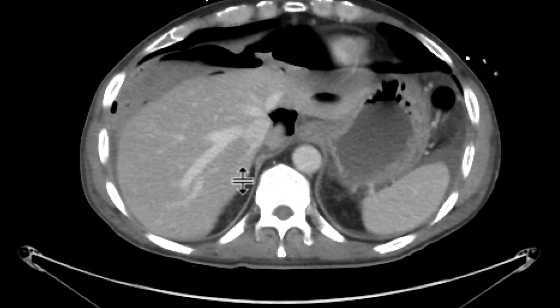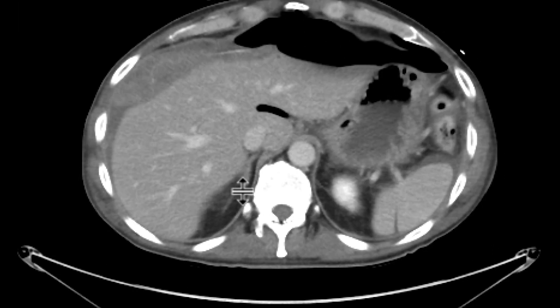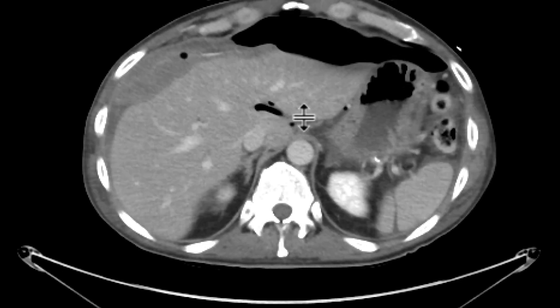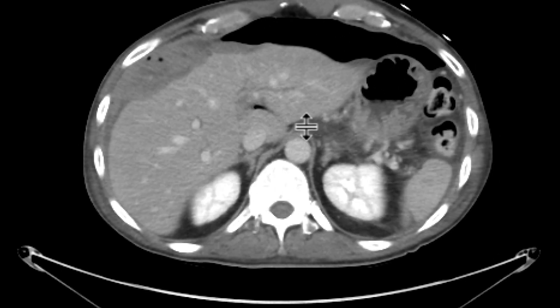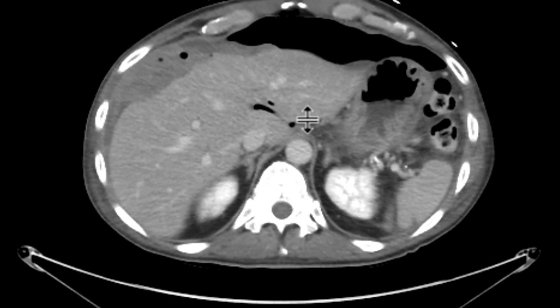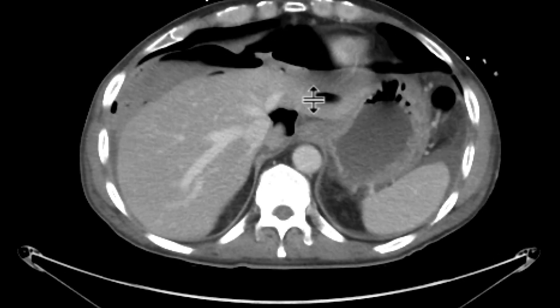As we look at our more delayed phase, we can see that area starts to layer out a little bit, and so there is active extravasation leading to this hematoma.